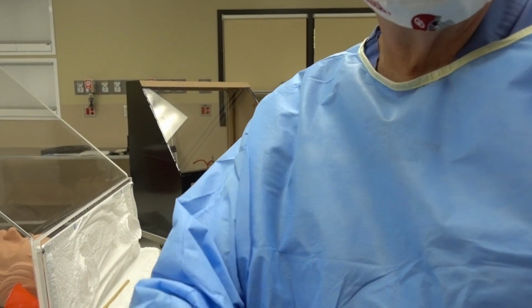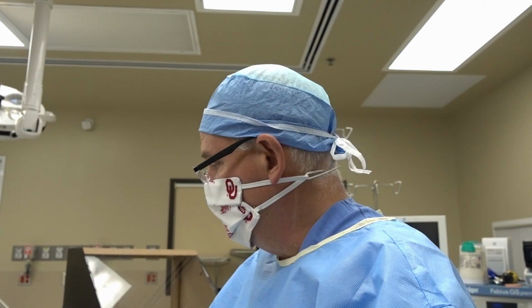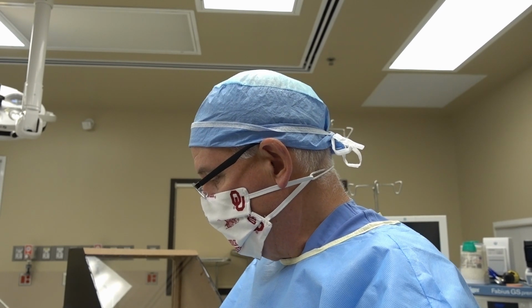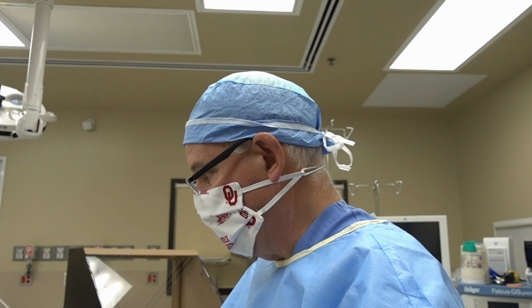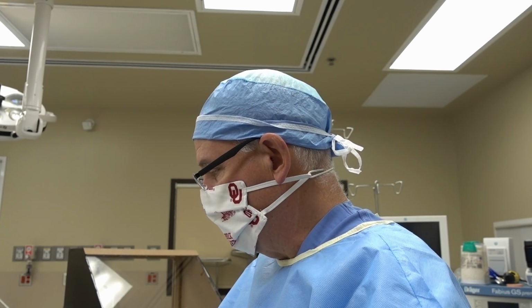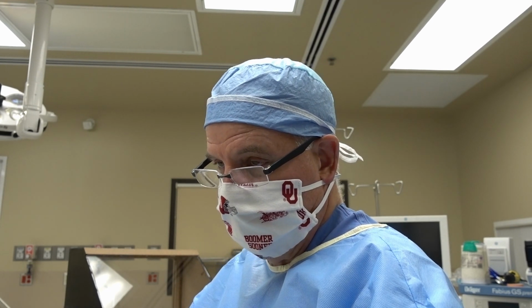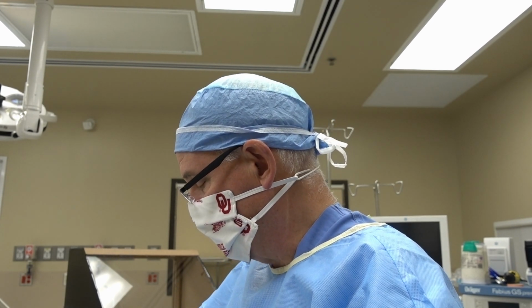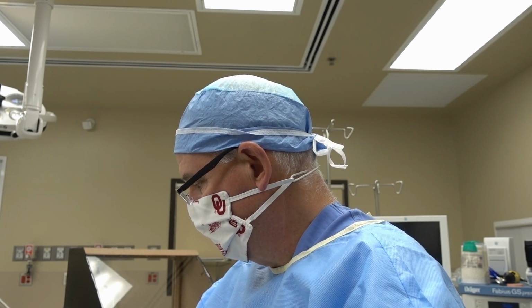Again, we're going to share these plans with everyone probably next week. And so you're welcome to build these, you're welcome to modify them. I will talk to my legal staff at the hospital, see what informed consent documents you need to have for the patient. You're just trying to protect your staff. This is not an FDA approved device, but it is a PPE. I mean, it's a protective device for our staff and our doctors.